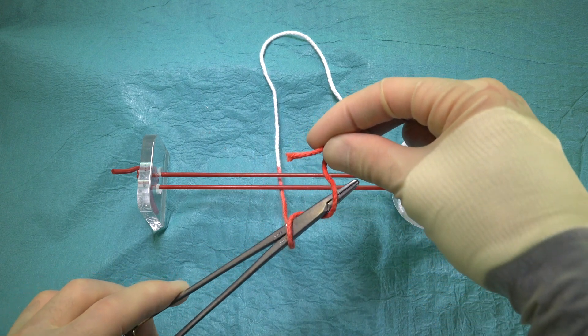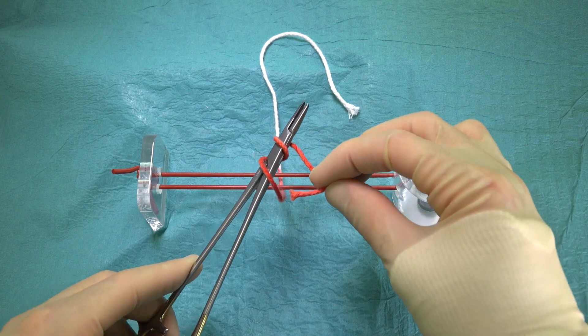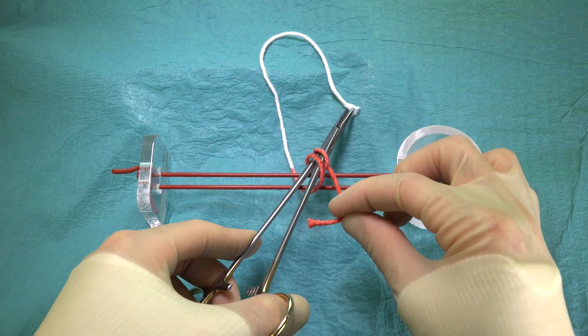The needle holder is then used to pick up the end of the suture that lies away from us, and pulls it towards us, passing it through the loop as it does so.